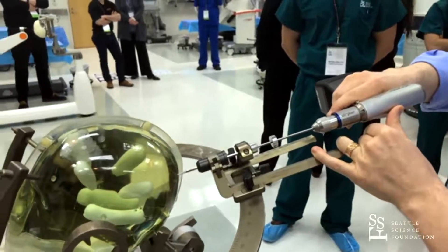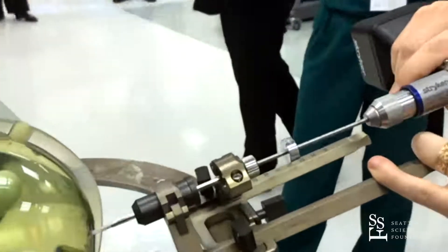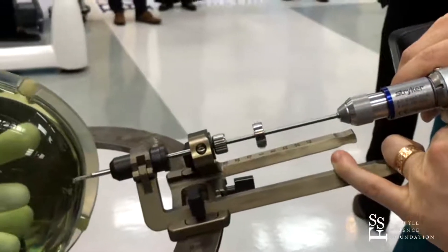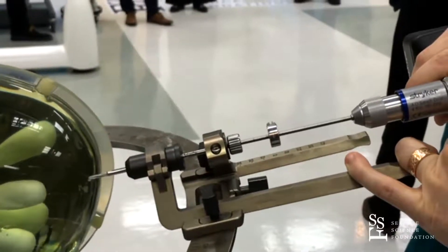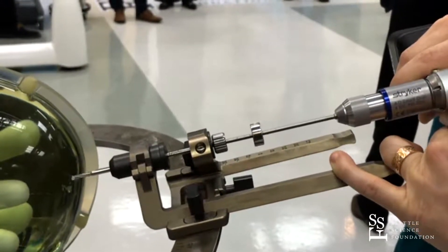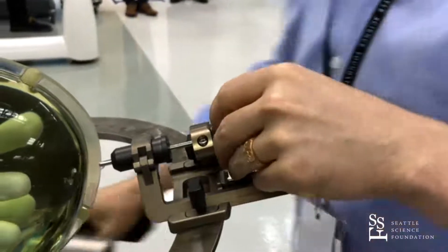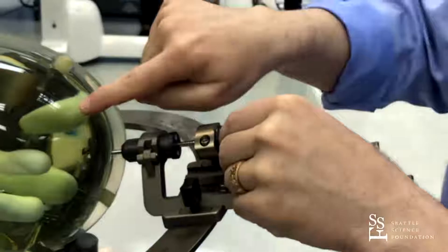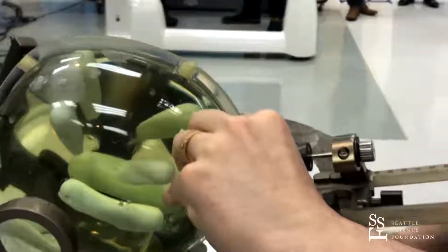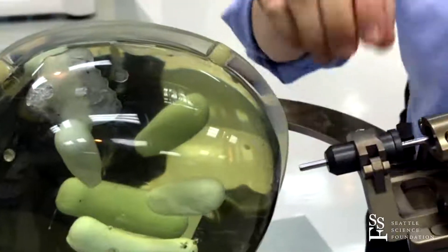Under stereotactic control, we place a twist drill hole — in this case, through plastic instead of skull. Plastic likes to melt. This is a gel brain with a model lesion inside; let's assume that's the shape of the hippocampus. Because this plastic melts, sometimes it doesn't want to take the bolt, but we'll see how it works here.